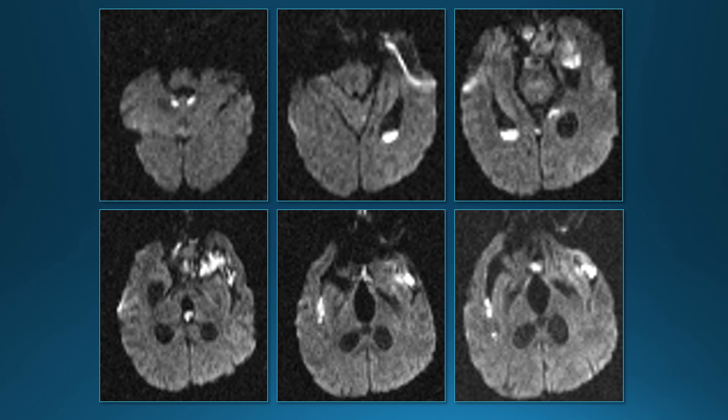On diffusion-weighted images, the pus has restricted diffusion, similar to the way pus within a pyogenic brain abscess has restricted diffusion. We can see restricted diffusion settling in the dependent portions of the ventricles and in the fissures, due to the pus mixed in with the CSF. We don't always see this with pyogenic meningitis, but if you see it, that's a pretty strong sign you're dealing with a pyogenic infection.